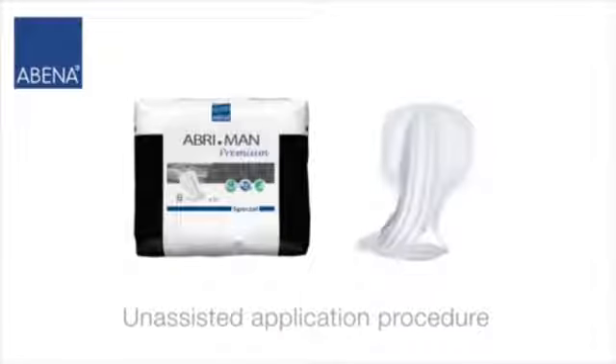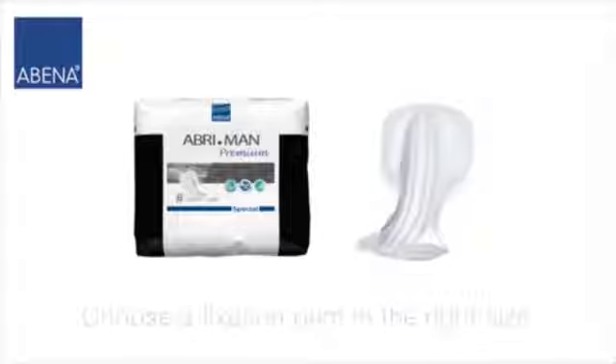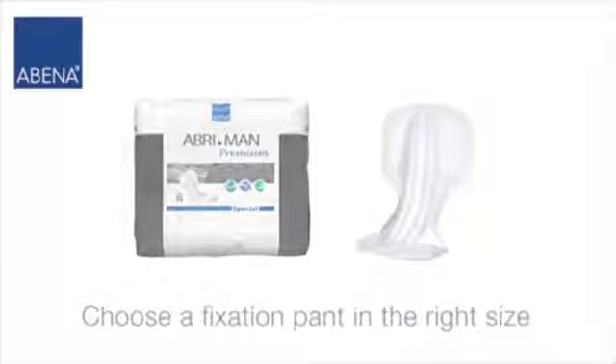This video describes the unassisted Abri-Man application procedure. Please ensure you select a pad with proper absorbency and fixation pants of the right size.